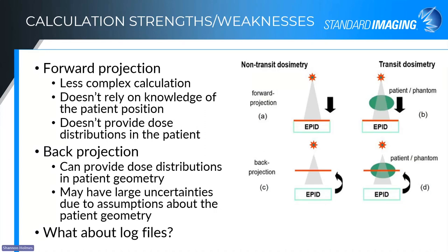Exactly. So you are missing out on some positioning information. It's kind of looking at the ideal scenario, as you said. Yeah. The in vivo portion of the measurement has to come from something that's actually after the patient. Yes, exactly.